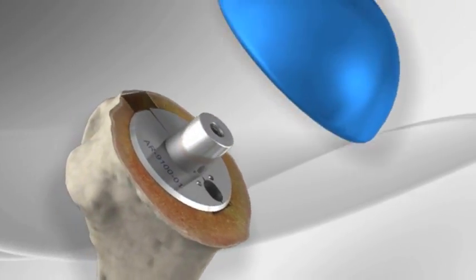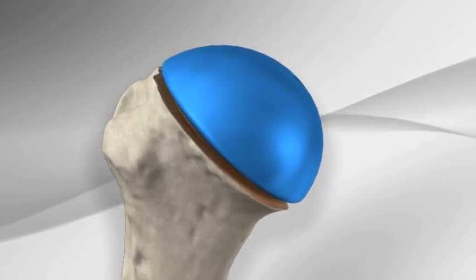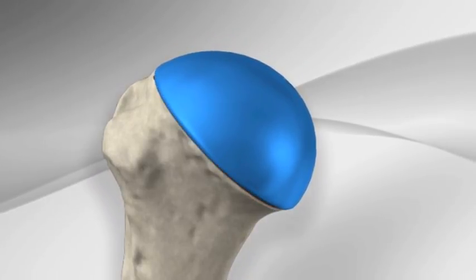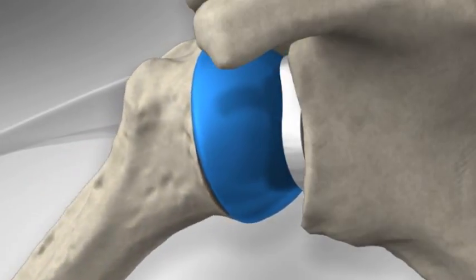A trial of the replacement joint surface is conducted. The surgeon tests the range of motion and stability of the prosthesis.